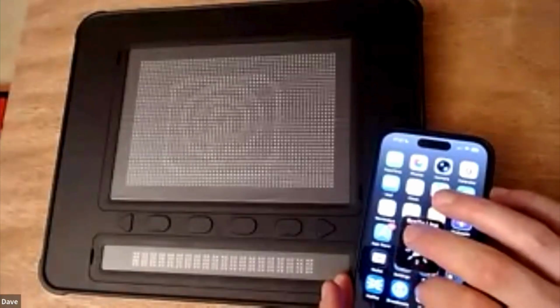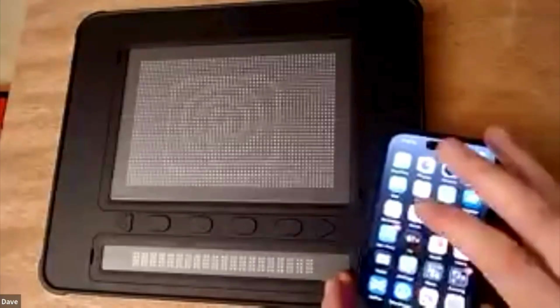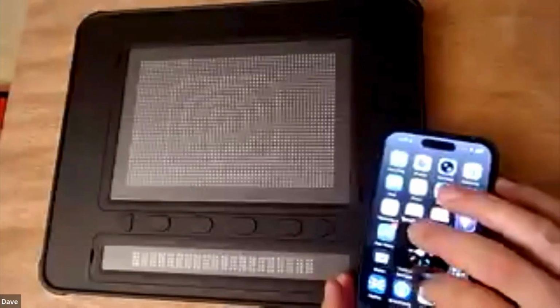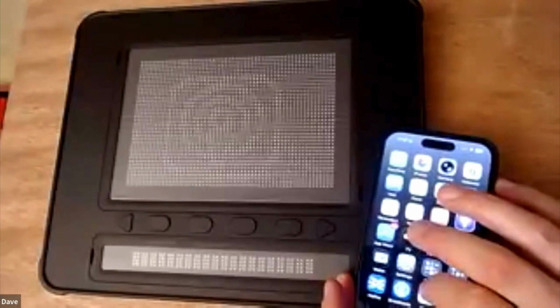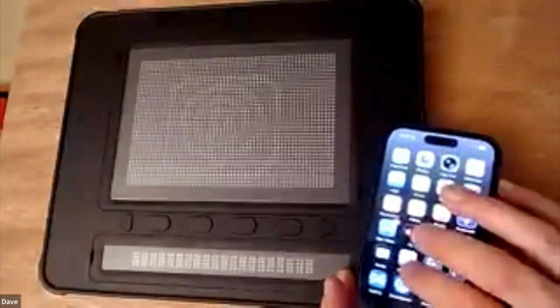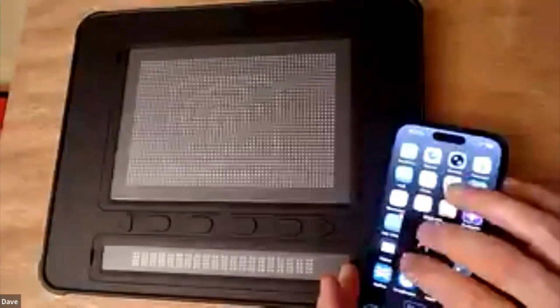Braille line thickness. Again, the idea is that if there is an icon in focus, you can change the thickness of those lines. Braille horizontal pan. And then we've got rotor options for horizontal and vertical pan. Braille vertical pan. Again, they've not really been fully implemented as far as I can tell. Your mileage may vary, so I'd love to hear from you if you've had a play with any of these settings. Voices, comma. And then that's it for the new things in the rotor. So you've got the panning and the zooming.